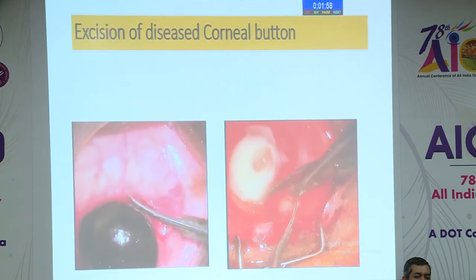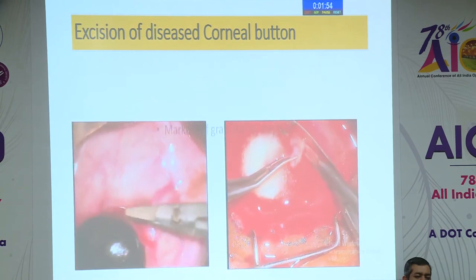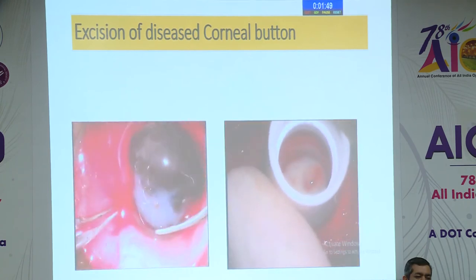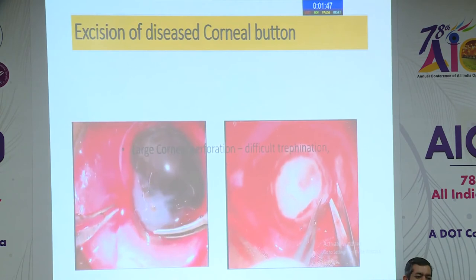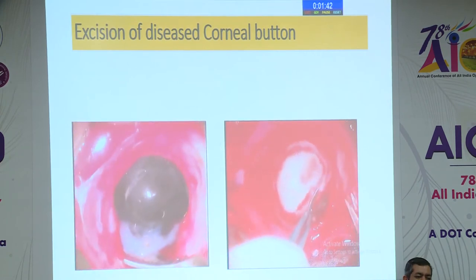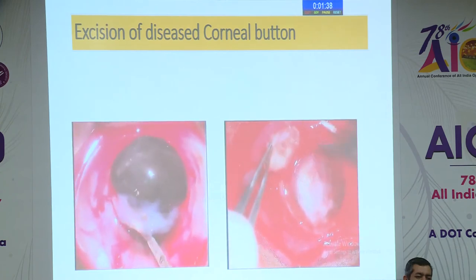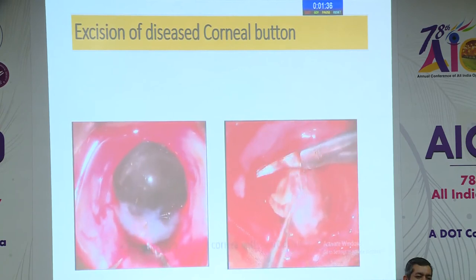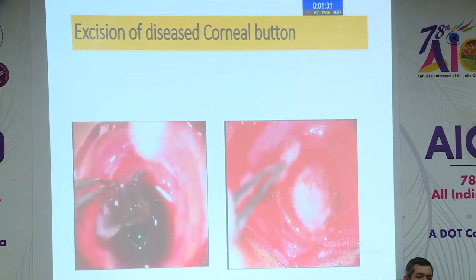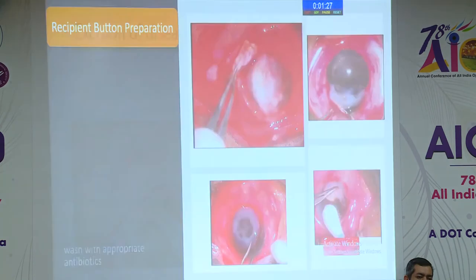In these cases, we have to do a conjunctival peritomy as the limbus is involved. Many times even marking with the trephine is not possible because of the involvement of the sclera and the larger size of the tissue involved. And even the anterior chamber is invisible, so it is very difficult to even mark and enter into the anterior chamber. With all precaution, we have to do it very carefully, and we have to excise the complete diseased scleral part also.